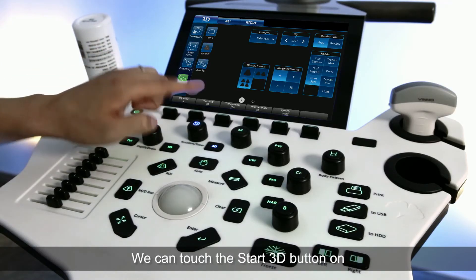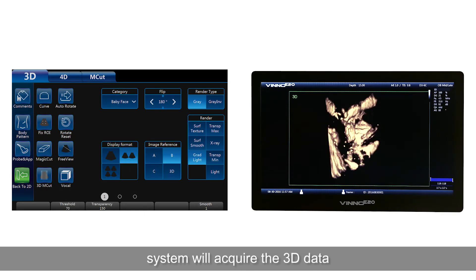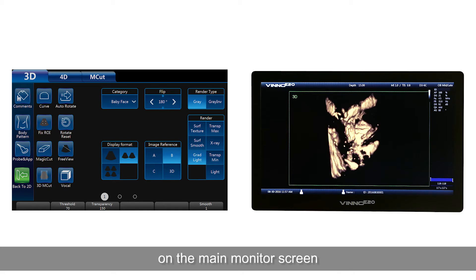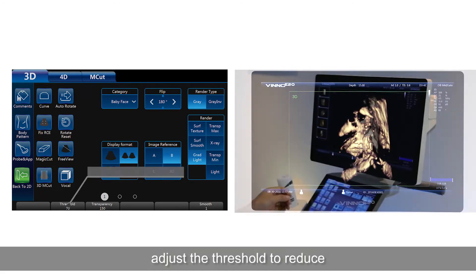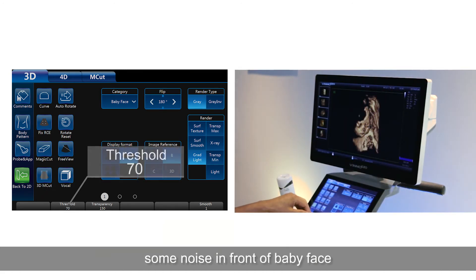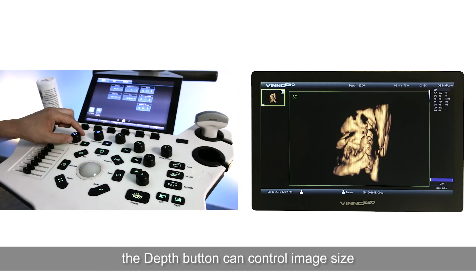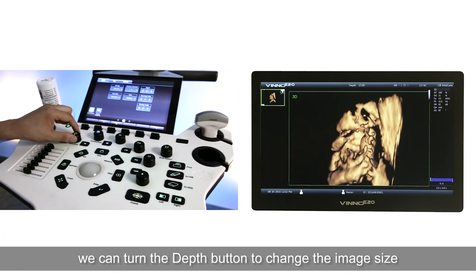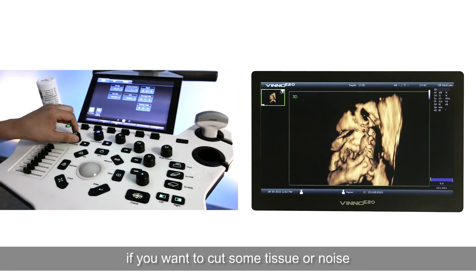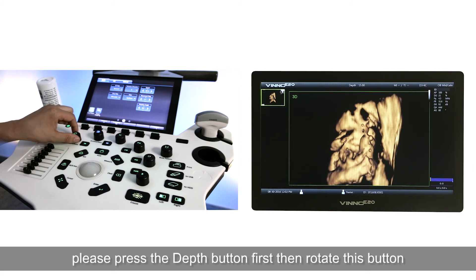Start 3D: touch the Start 3D button on the touch screen or press the 4D button directly. The system will acquire the 3D data and then show a rendering image on the main monitor screen. We can choose flip angle to change the rendering image view direction. Adjust the threshold to reduce noise in front of the baby face. We can adjust the smooth performance of the rendering image using the smooth button. The depth button controls image size and rendering cut line position — turn it to change image size, or press and rotate it to cut tissue or noise in front of the baby face.